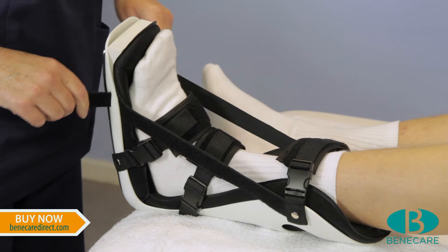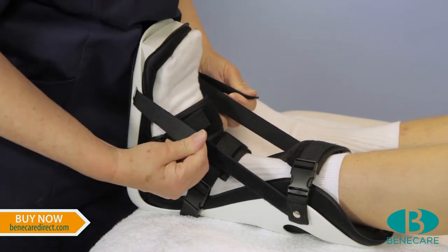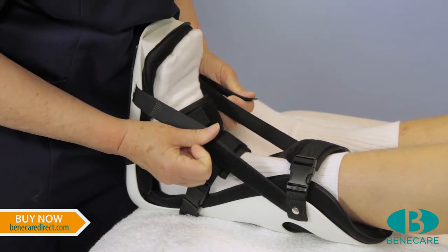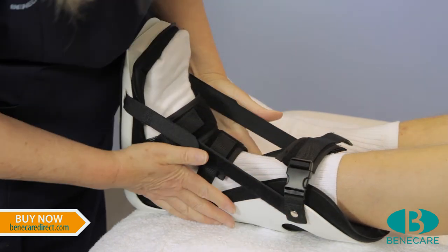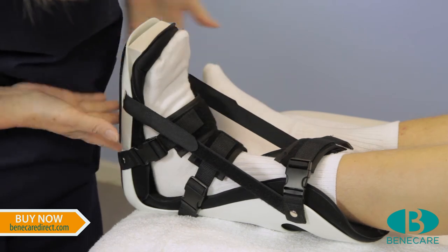Now secure the oblique straps, placing sufficient tension to hold the ankle in the optimum position. Ensure the splint is a perfect fit and does not cause constriction.